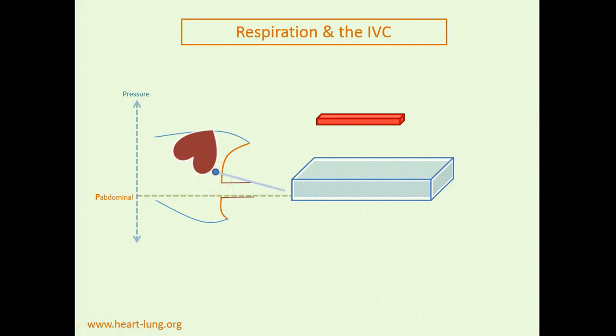So in patients who are completely passive with the ventilator, and so in some of the IVC papers, particularly I believe the one by Barbier in 2004 and Feissel as well, they were looking at IVC dilation, and that was in a patient population that was essentially paralyzed, not making inspiratory efforts, and they were also receiving relatively high volumes on the ventilator, I believe 8, 10, 12 cc's per kilogram.